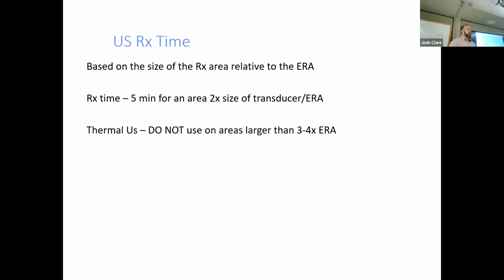Okay. All right, so let's play around with this. The big thing is keeping the sound head moving and then playing with the times for it. So at first, let's just start something really superficial, really light settings, make the duty cycle 20%, keep everything nice and safe. Just really your first step is getting used to moving the sound head as you're operating the machine.